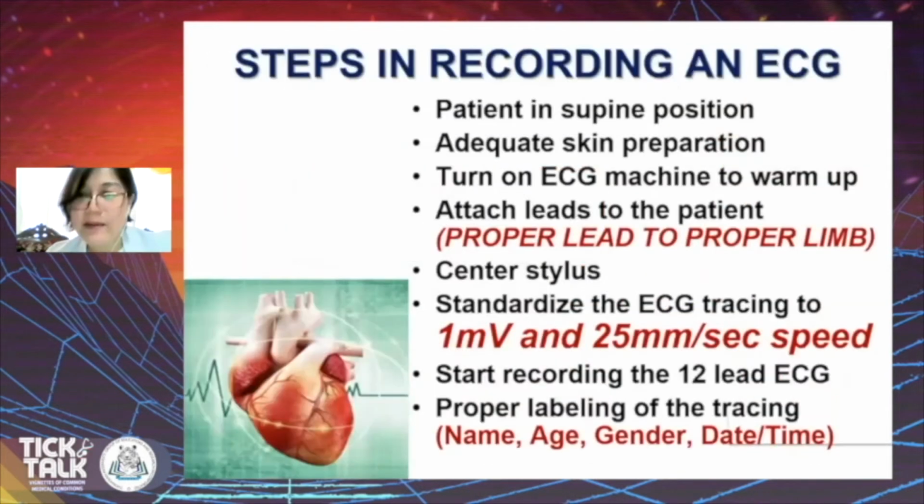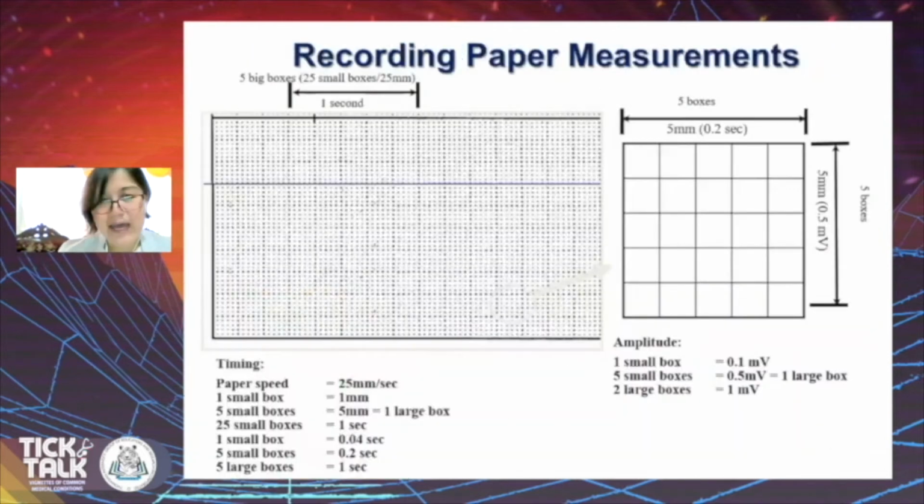So these are the steps on how to conduct your recording. Now, more often than not, we allot these particular steps to our secretaries or to our cardiac technicians. But I guess as physicians or as trainees, it is important we get to know and familiarize ourselves as to how we do an actual ECG recording. So this is just showing how an actual recording paper for your ECG looks like.